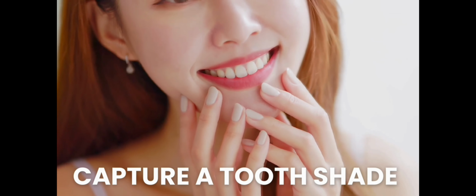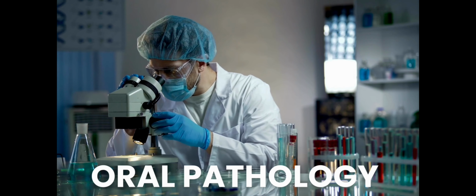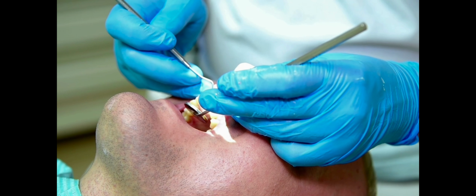To capture a tooth shade before preparation, to have a record of the color. Oral pathology: going forward, there are to be no oral pathology referrals generated without a picture of the lesion for our records. If we're not going to refer out for an oral pathology and we choose to monitor the lesion or inflammatory condition, then we would take a picture of it, use a periodontal probe as a reference guide, and when the patient returns 6 months later for the recare exam, we will follow up and make a comparison.